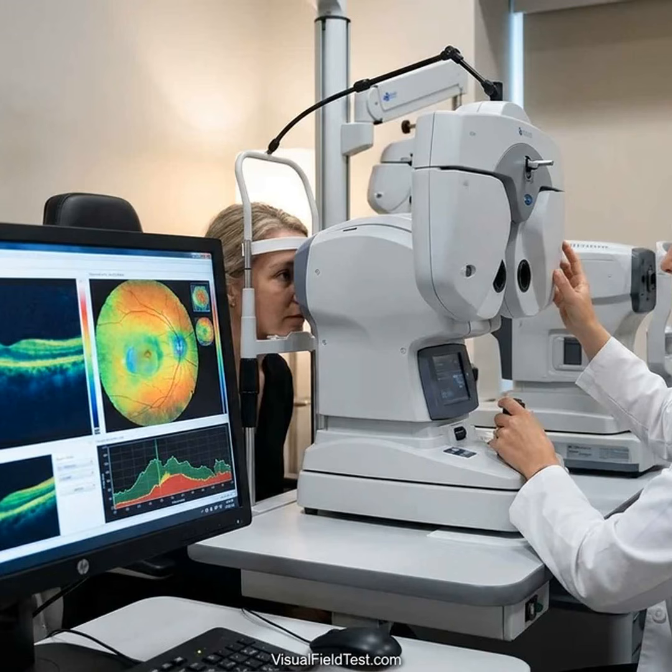All these factors mean that an OCT report should be reviewed by the doctor, not taken at face value. If something doesn't make sense, e.g. a sudden jump in thickness, the doctor will consider if it could be an artifact and may order a repeat scan. In fact, experts warn OCT results must be reviewed carefully for scan quality and errors.